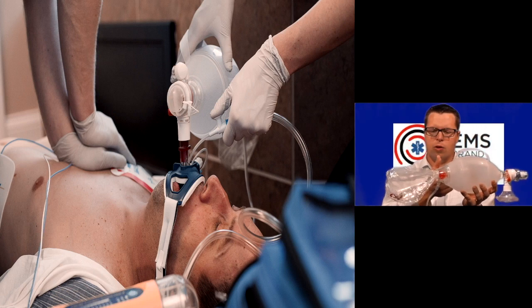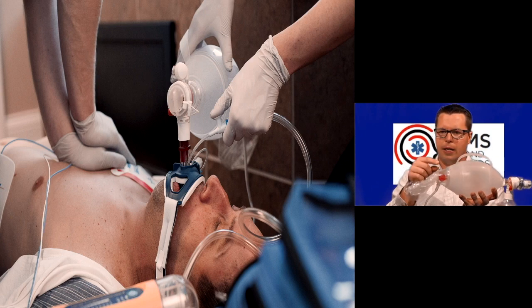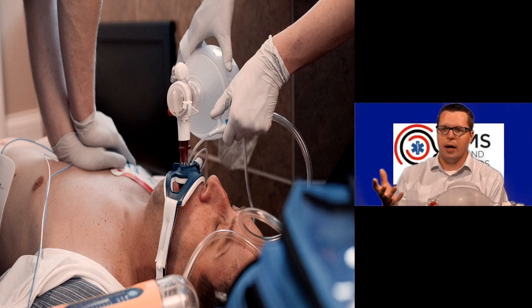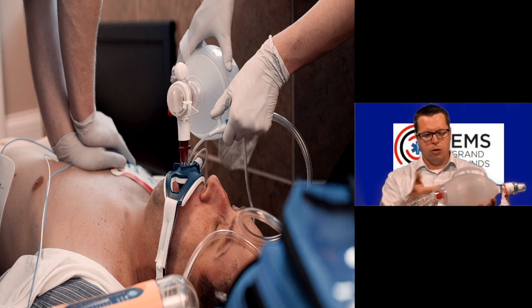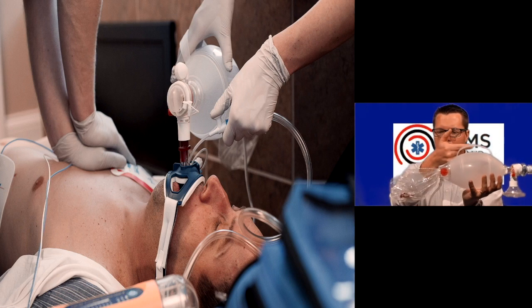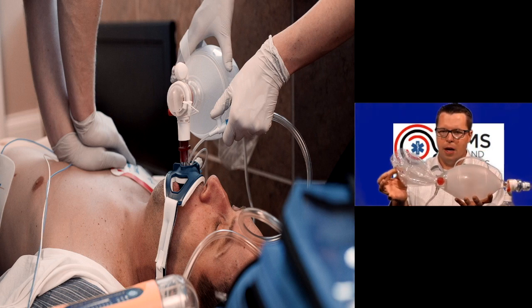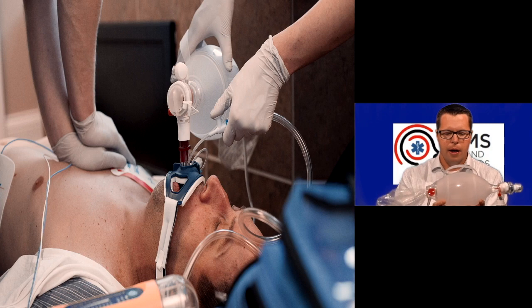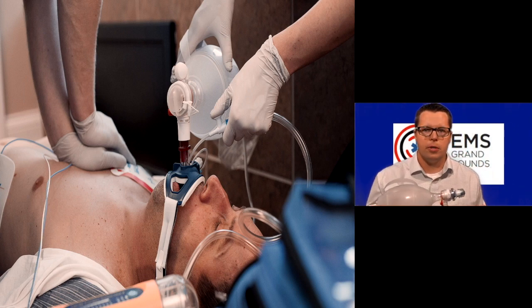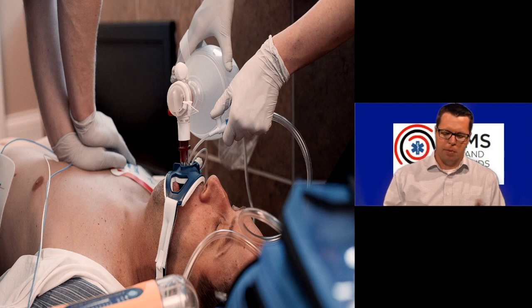If there's no air here or there's no flow, there's a valve back here that lets room air, 21% oxygen or wherever you're at, enter through the bag itself. Preferentially, though, when you release, it's going to suck air in through that port in the back from the 100% oxygen reservoir. This is theoretically how you're going to get 100% oxygen with each of these bags. It doesn't end up being 100% oxygen, but we'll talk about that in a minute.